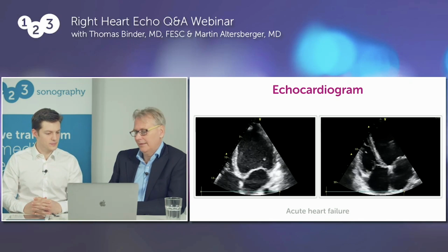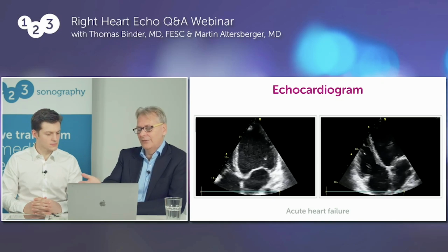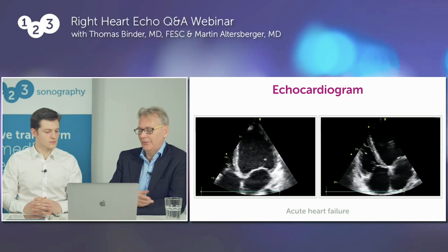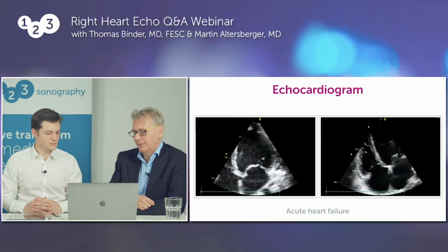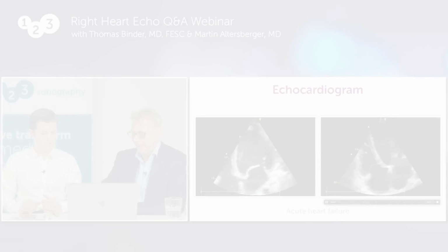Yeah, I think it's just a beautiful example, right? You can see that this is the reason why the parameters sometimes don't fit together. TAPSE seems to be okay, but look at these mid and distal areas here, they're just very poor. Now let's move on.